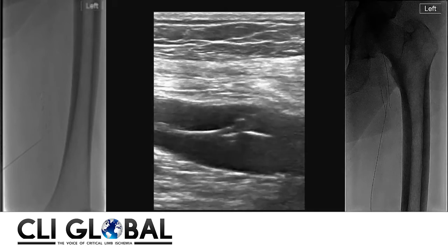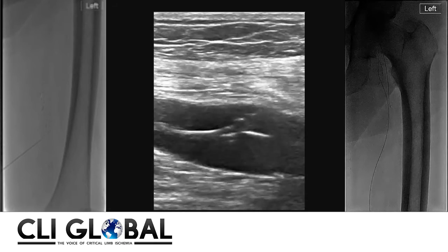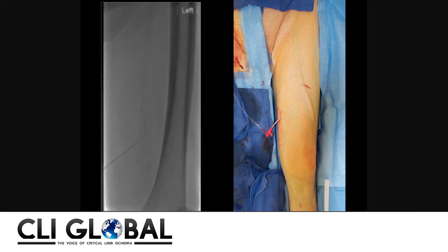To the left of the screen you see the needle under fluoroscopy with an 0.018 wire — in this case a V18 wire made by Boston Scientific. The middle panel shows the needle under ultrasound accessing the anterior wall of the superficial femoral artery with the wire through it inside the occluded vessel. To the right you can see the 0.018 wire being advanced under fluoroscopic guidance all the way to the common femoral artery. After accessing the occluded vessel, we placed a 4 French Precision sheath made by Terumo, which has a micro dilator advanceable over an 0.018 wire.